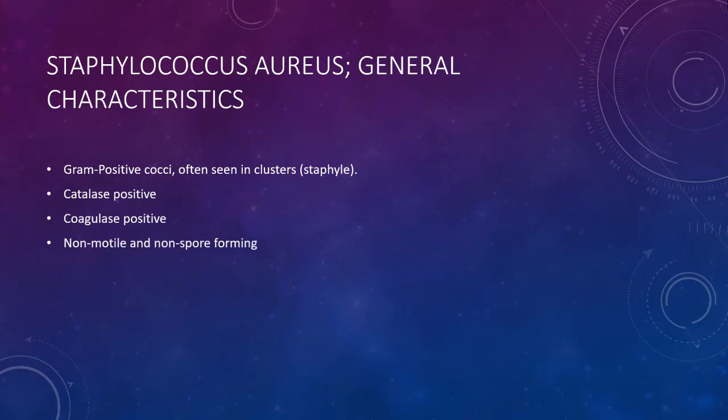These are non-motile and non-spore forming cocci, and they are heat tolerant, as well as having the ability to grow in the presence of high salt concentrations.